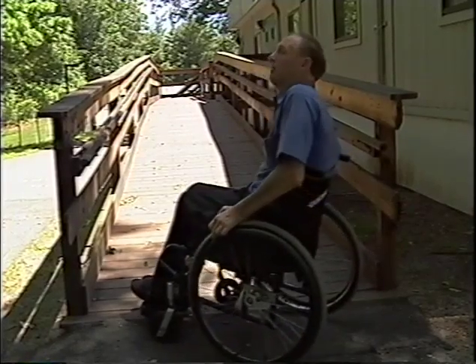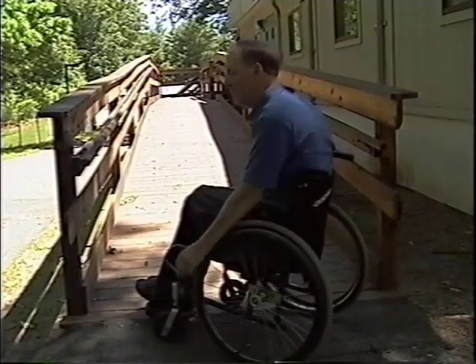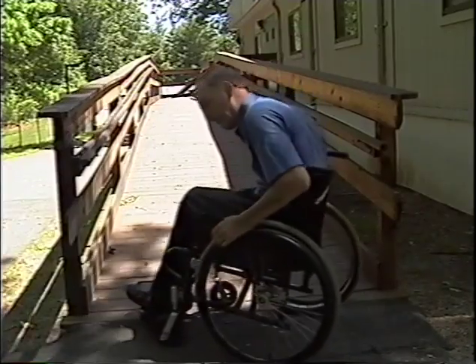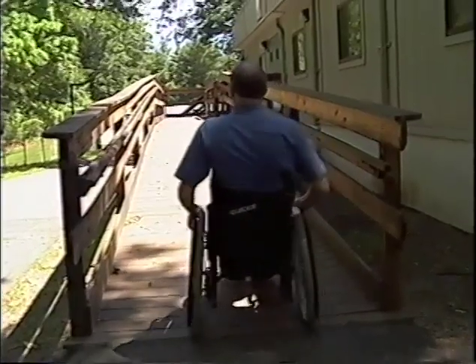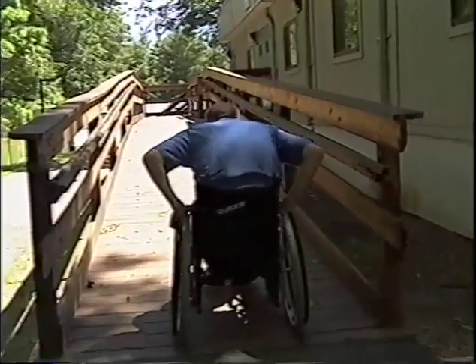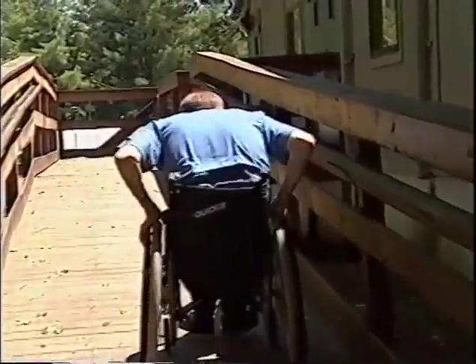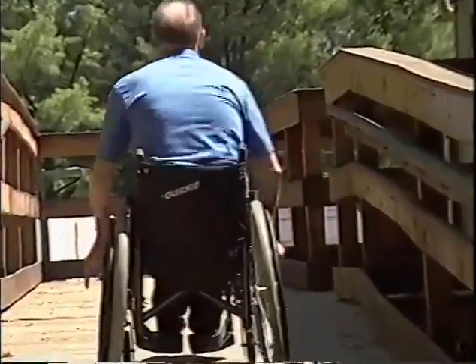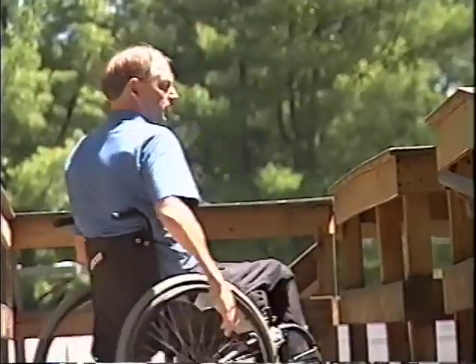And then you want to be throwing your weight forward first and using that snapping motion, which was at the end of your roll, to shoot your weight back up and then fall down again. So it should be almost like rowing a boat. You're on the ramp, you're pushing forward and letting your body fall down and get into a rhythm. And you should be pretty good.